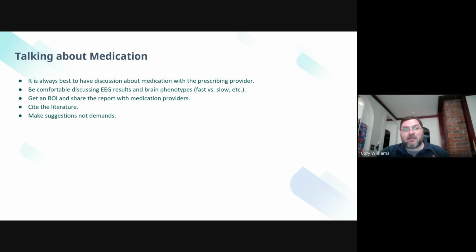And I might look at an EEG and say, this person needs an SSRI. And then Susanna would say, I would never give this person an SSRI because of X, Y, or Z, right? So you want to make sure you stay grounded in the literature and that we're making suggestions or recommendations, certainly not demands.